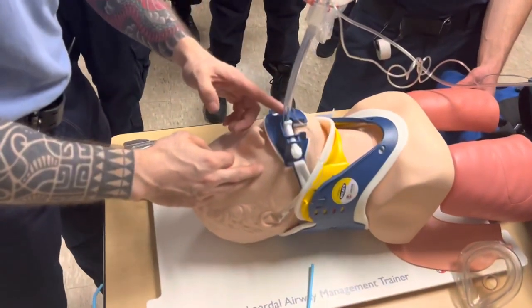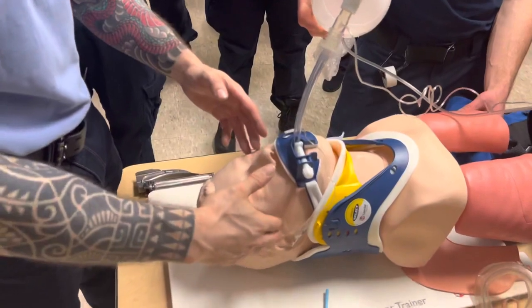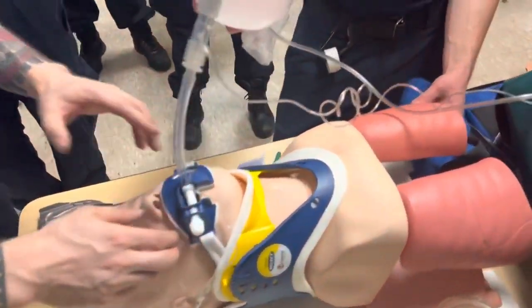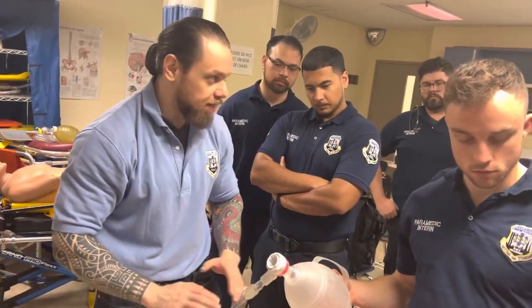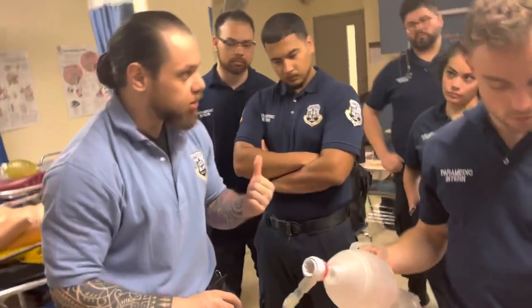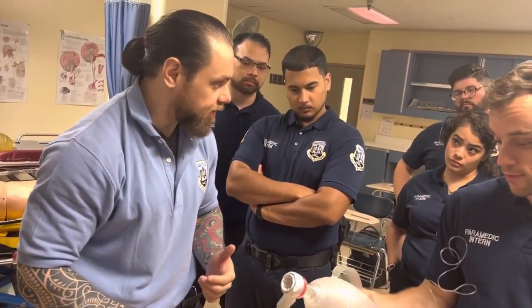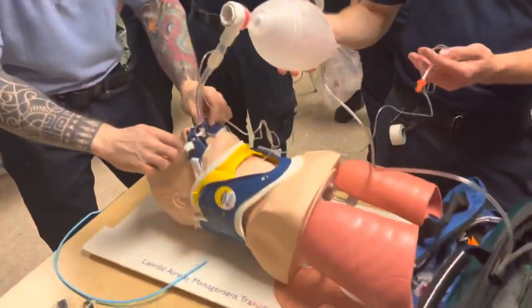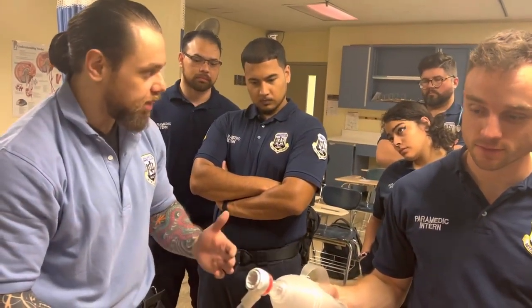Displaced, excellent, right? And then what I do is, let's say we noted 21 at the lip line. When the firefighters or whoever bring the patient down, I look again, where's my lip line? And then I recheck all the objective data: end-tidal CO2, pulse oximeter, lung sounds, everything. The moment one thing doesn't look good, I have to go back and verify everything is in the right place. I would get somebody holding the C-spine, open this up, get my laryngoscope in, and make sure it's in the right place. So I verify before I start my transport.